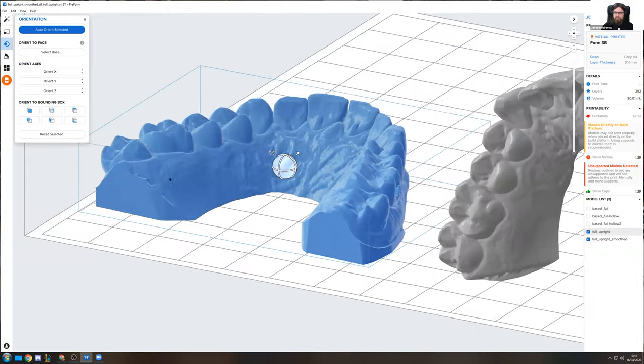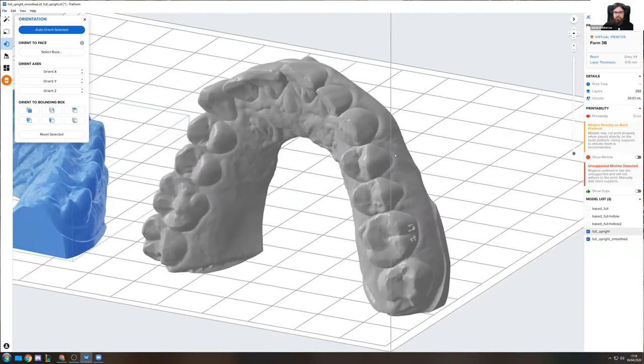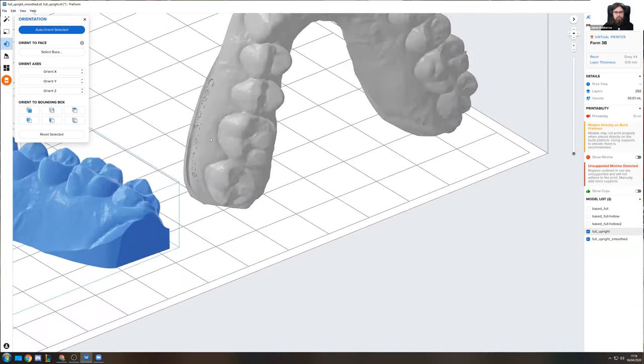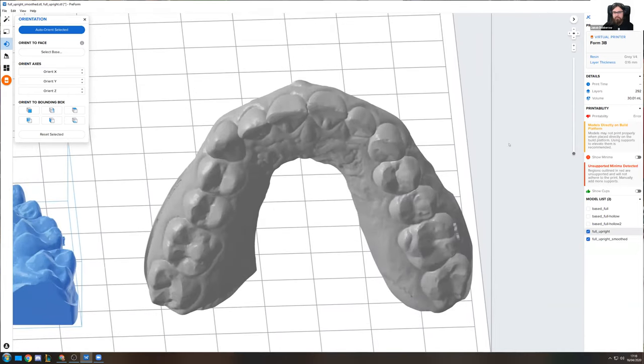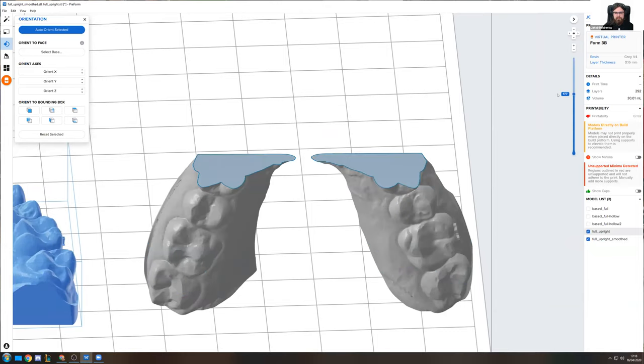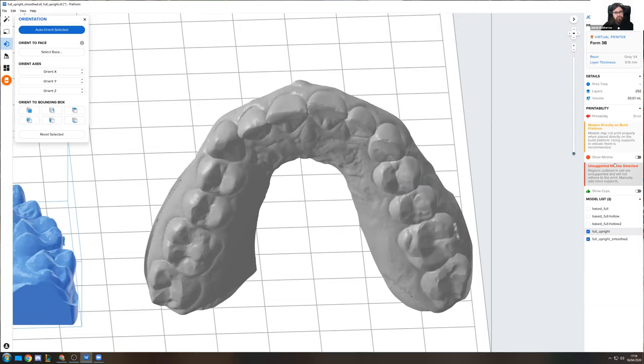And now, because I have this arch smoothed out on the inside, going through it again, you can see that it's now just one minima, which came from the letters again. But if we go through this whole thing with the slider right here, we can see that this is now much, much smoother on this arch that we're forming there. So we don't need a support there anymore. We can still put in one or two just to be on the safe side and to support this model while it's printing out.